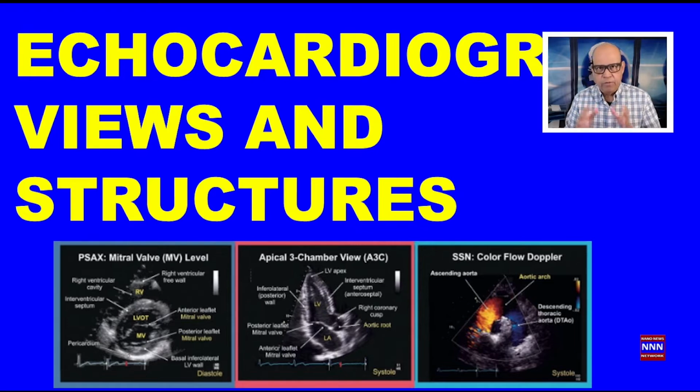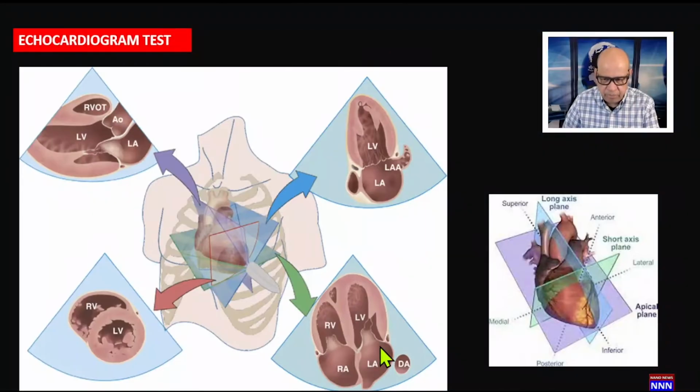There are 4 or 5 main positions where the transducer is placed, and in special occasions, the transducer can be placed in multiple locations and different angulations, looking at almost every structure in the heart, from the heart chambers to pulmonary arteries or pulmonary veins and the vena cava, all kinds of structures. So let us begin with the main presentation.